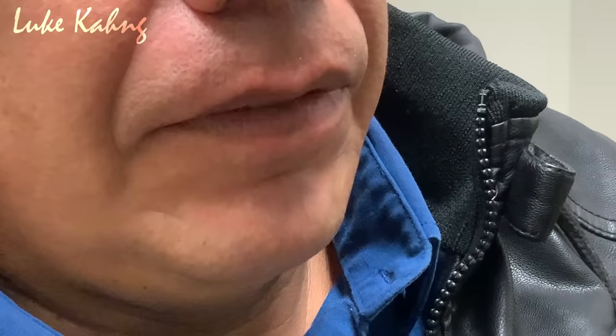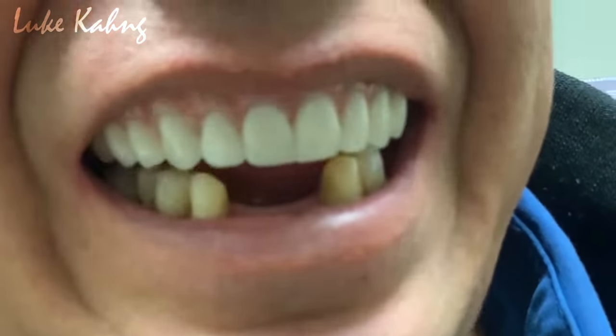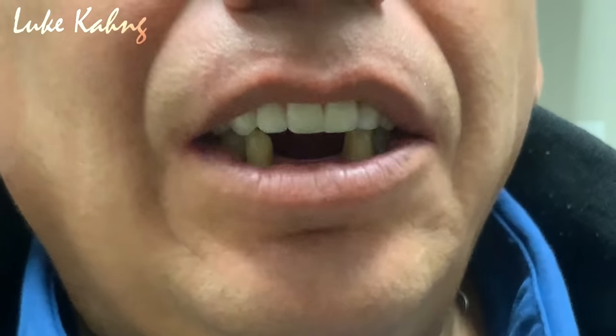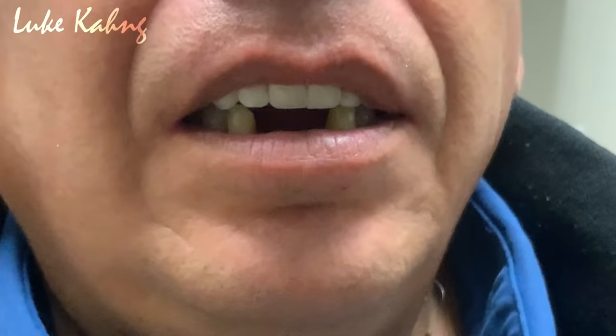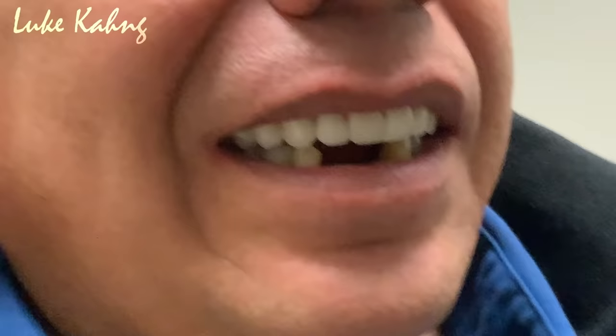And we're just testing the fine movements. Here, one of the things you want to make sure is that when the patient comes in for this initial visit, you want to get to at least 90% to where the patient is comfortable wearing it. Don't ever let them leave with a denture in pain and say, come back and see me. You don't want to do that. You want to make sure that the next couple visits when the patient comes back, the patient is just asking for minor adjustments. And this is great for the dentist because they're gonna tell their friends that this dentist made them a denture that needed minimal adjustments.